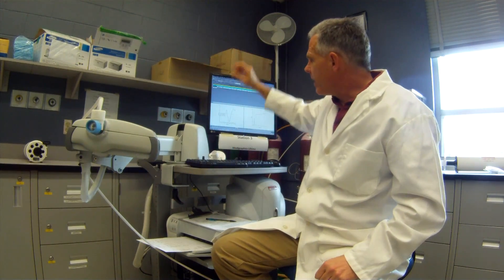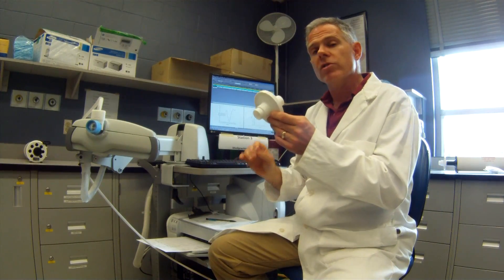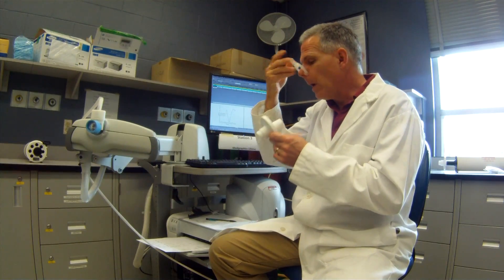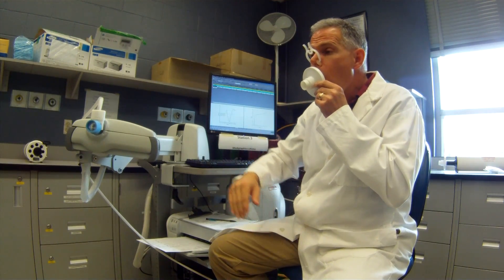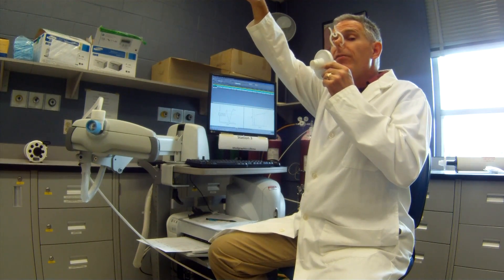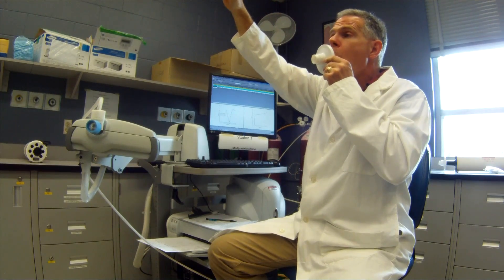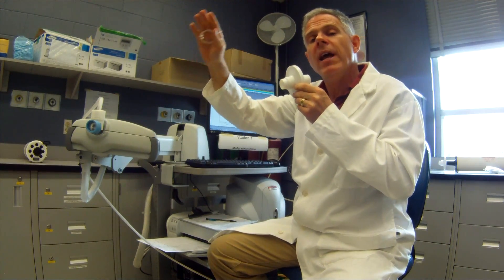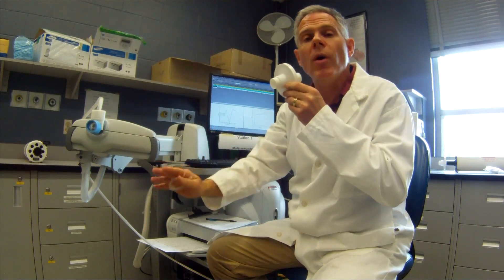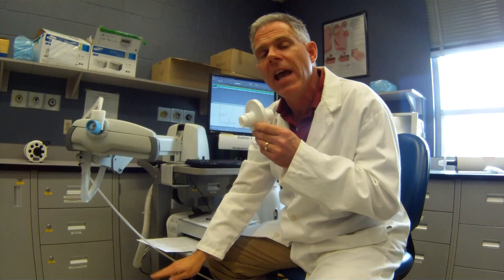They take a big breath in of 100% oxygen all the way in as much as they can. There are guides on the machine and it's a slow flow rate. So you want to demonstrate to your patient that they're going to take a big breath in and blow it out at relatively slow flow rates. Nice even breathing, big breath in at a nice even flow rate, all the way in as much as you possibly can until your lungs are full, and then blow it out at a nice even flow rate. Just keep blowing and keep blowing until you've blown all the air out you possibly can.